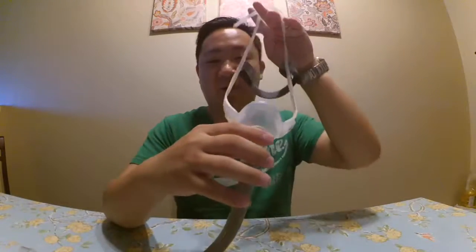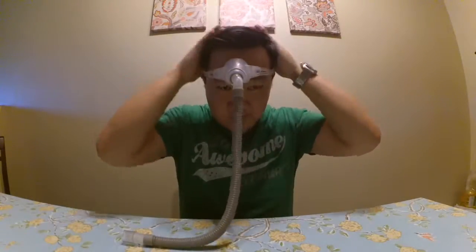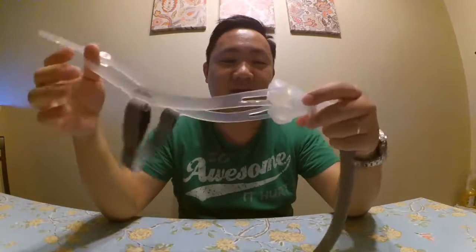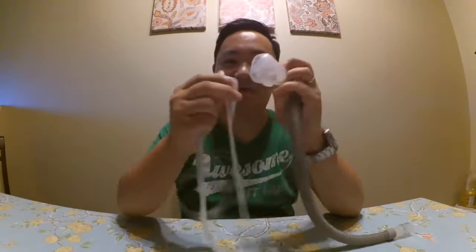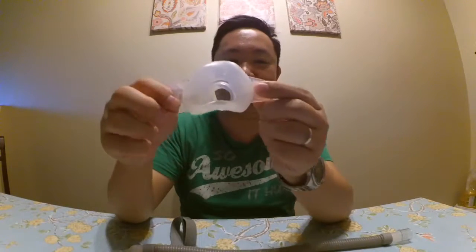What I like about this is it's so easy to put on — you just put it there, done. With other masks you have to take off the clip, put on the clip, take it off, put it on — it's so hard. This one is so easy, and cleaning it is easy too. Just remove the headgear and then remove it from the tube, and then I wash it.